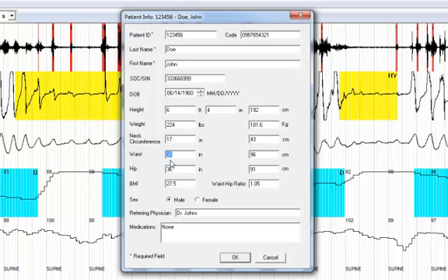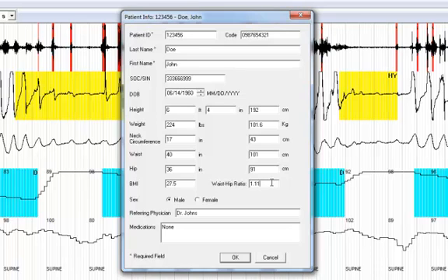For example, if I enter in 40 inches and hit the tab key, it automatically changes to 101 centimeters and the waist to hip ratio changes as well.